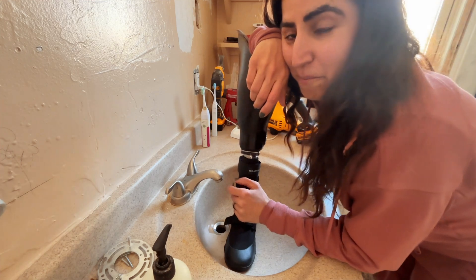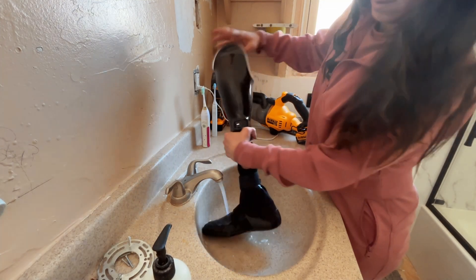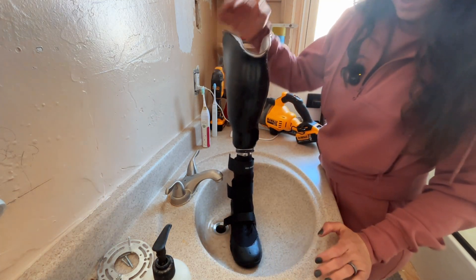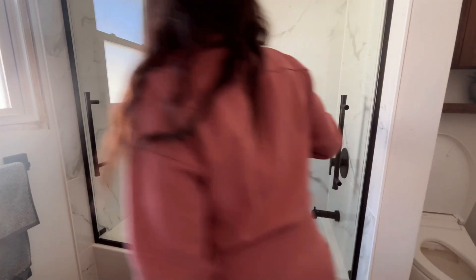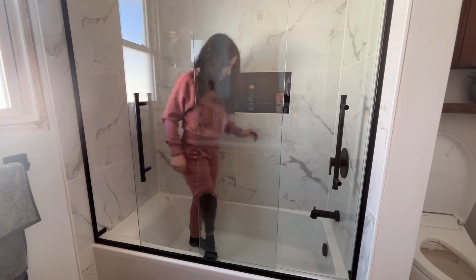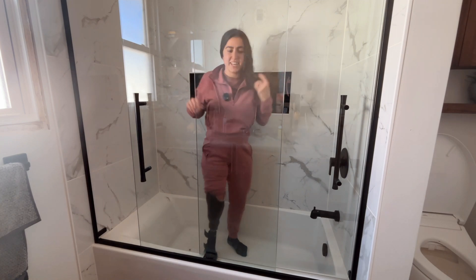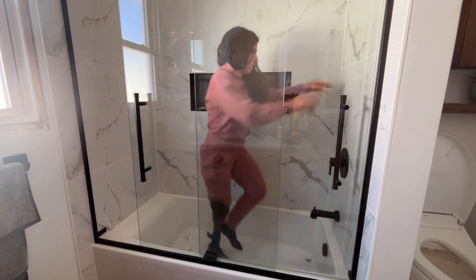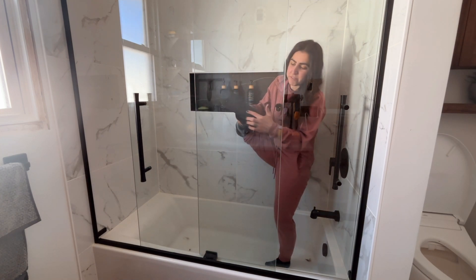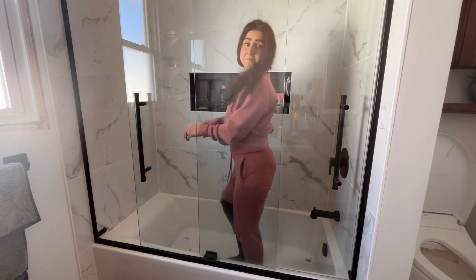We are currently demoing our bathroom — let's put the water to the test. Should we do this in the bathtub? I want to see if it's slippery or not. So this side of the bathroom is done. It's definitely grippy. The sole they provide on here, even when wet, definitely has some grit to it.